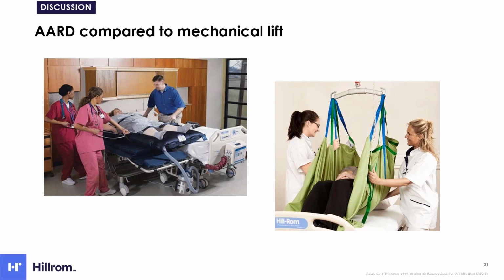After use, it needs to be deflated, removed from under the patient, and disinfected. So I think this may be a usability concern that can create a barrier for caregivers to use.